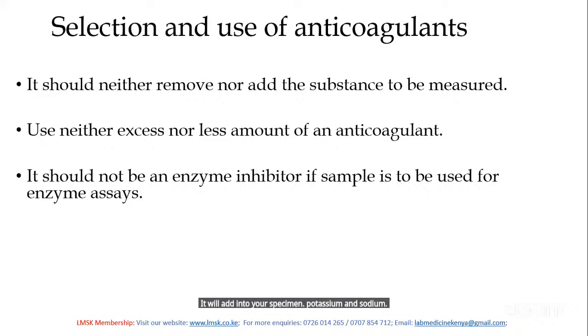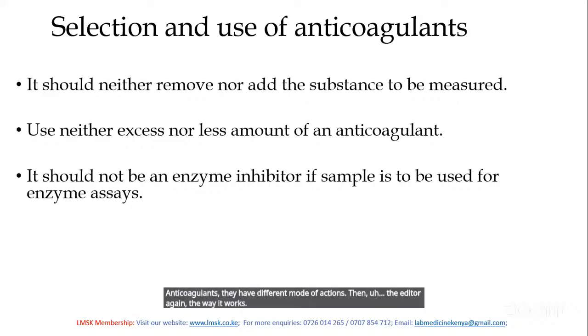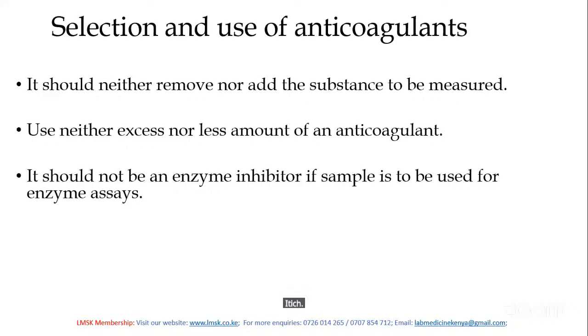And if you know the mode of action of these particular anticoagulants, they have different modes of action. EDTA, the way it works, it chelates calcium, removes calcium from the specimen.